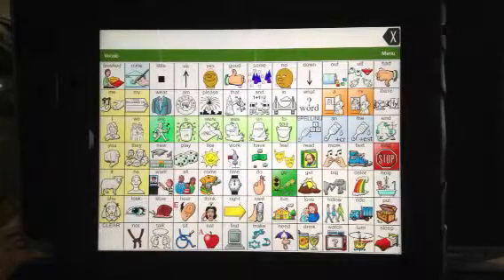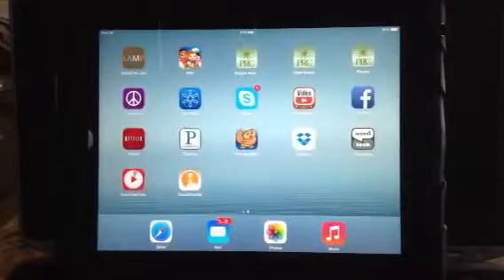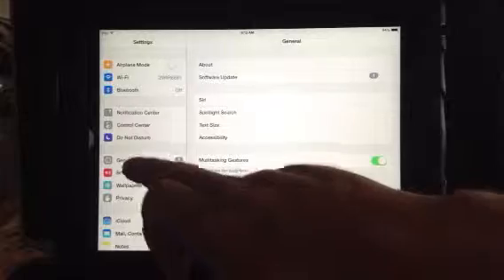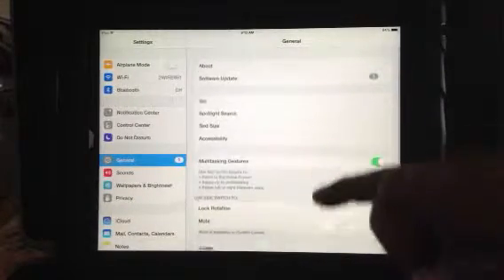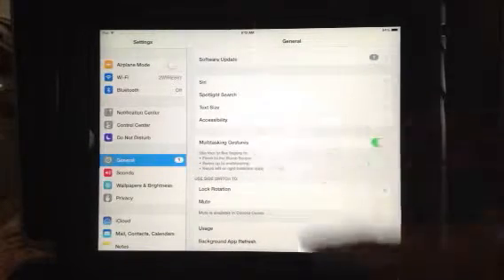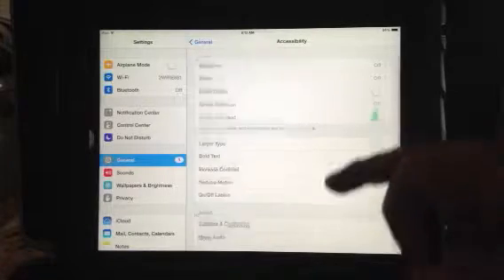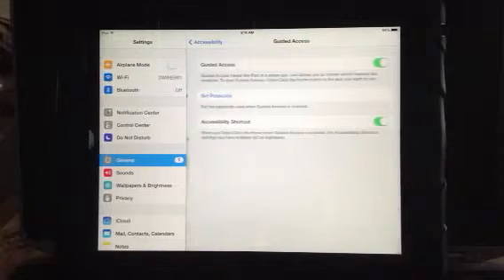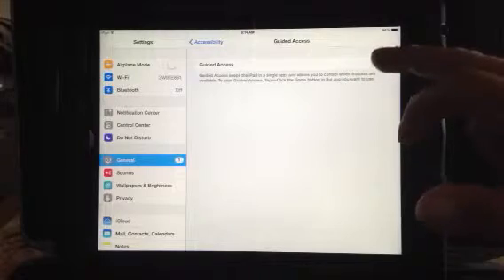First we're going to learn how to turn on Guided Access. Get out of the app you're in, then go to the Settings menu, which most of you know how to find. Then go to where it says General, and scroll around a little bit — sometimes you have to go up or down — but what you're looking for is the one that says Accessibility. Hit that one. Now what you're looking for is one that says Guided Access. Right here it says Guided Access, and mine is on — yours is probably going to be off. Turn it on.